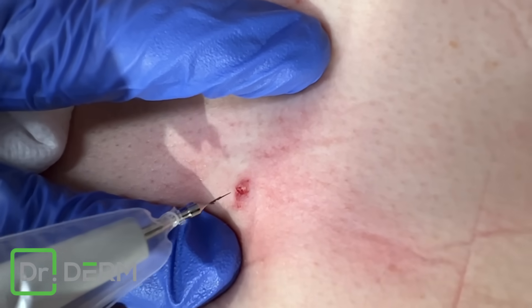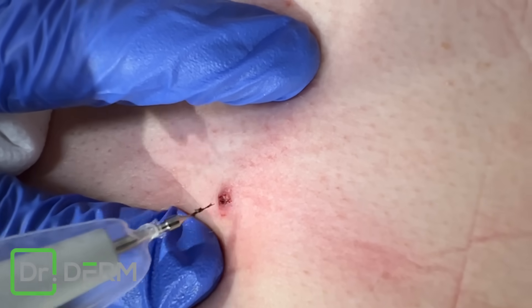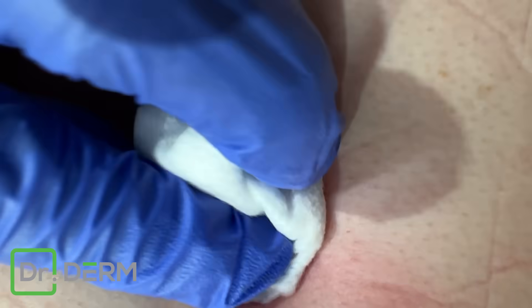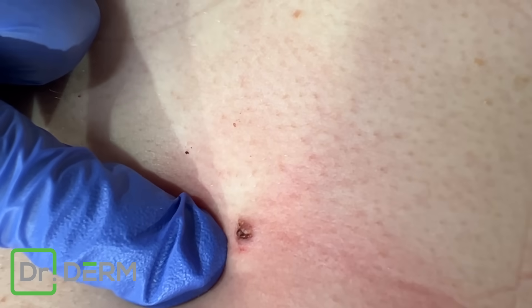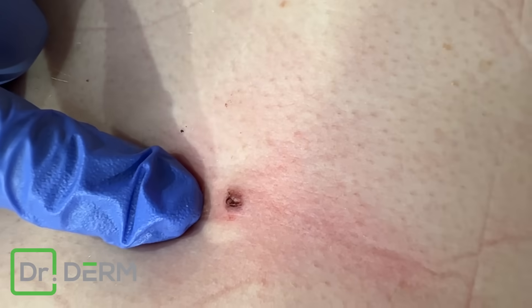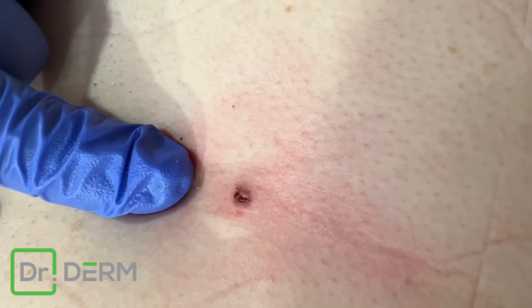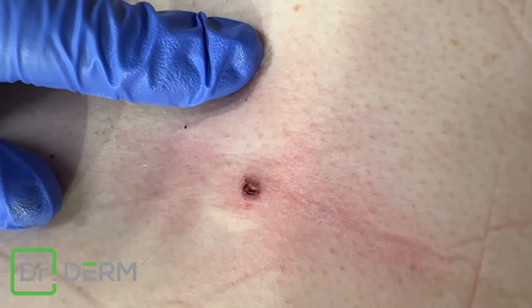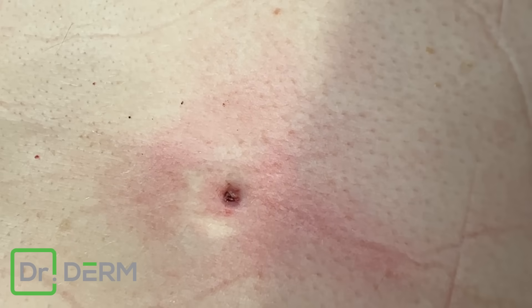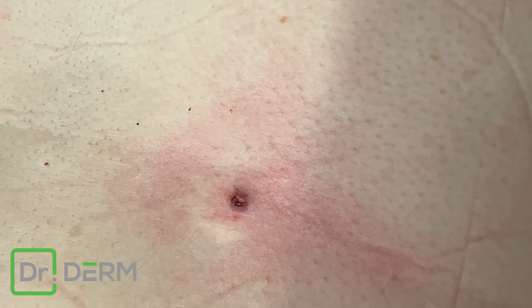All right. So now he has this — if I use this tiny little heat in the center, that's the magic of keeping that from coming back. I think that's going to shrink up really well. You almost replace the cyst with collagen or even a little scar tissue. It'll be tiny — smaller than if we did a punch biopsy. A shave wouldn't have been deep enough. And of course I can excise it, but then you need stitches and there's additional cost. So to me, this is the best cosmesis, the most efficient way to get rid of a bigger blackhead — almost like a tiny pore minimizer.